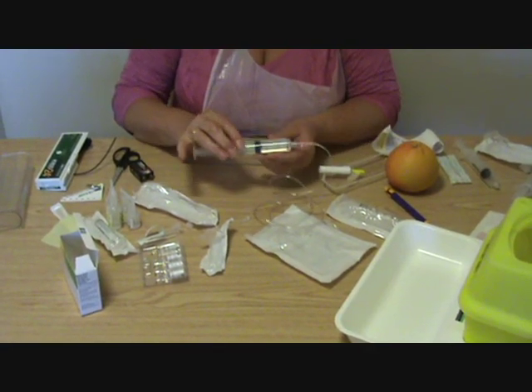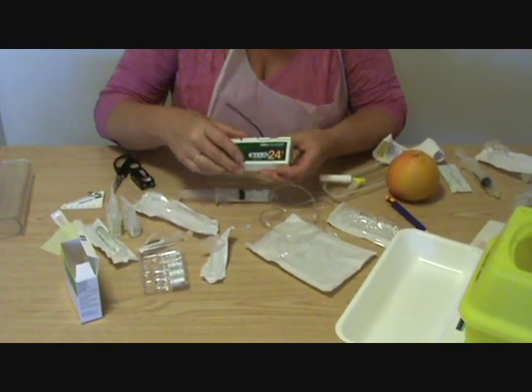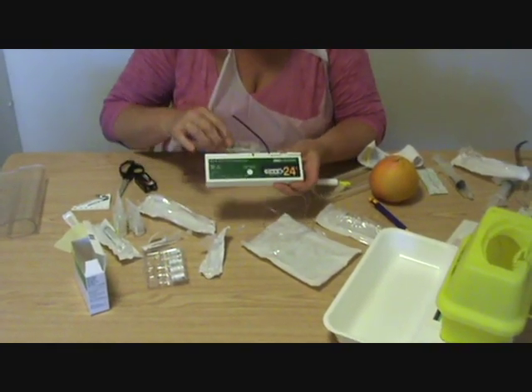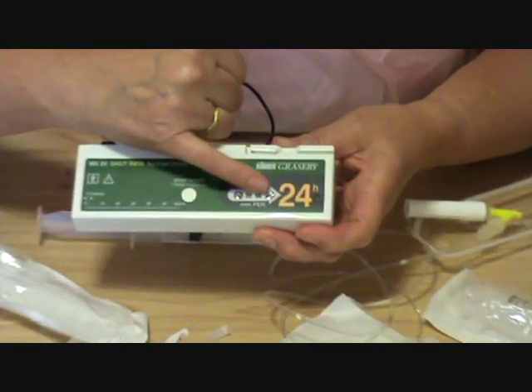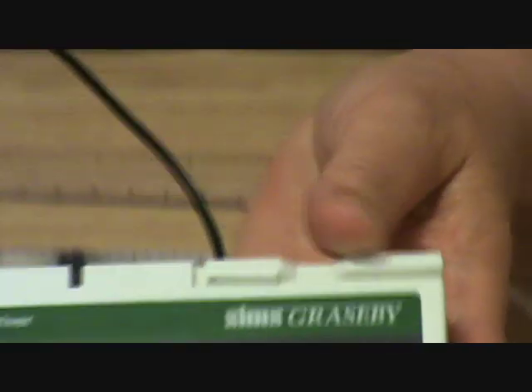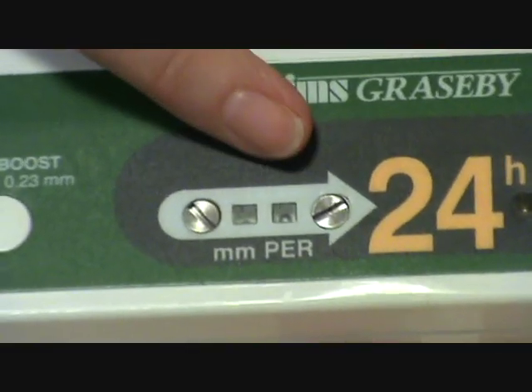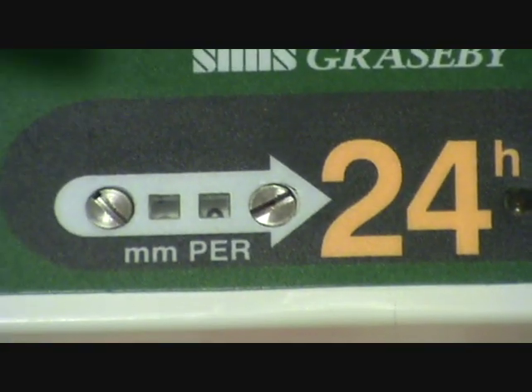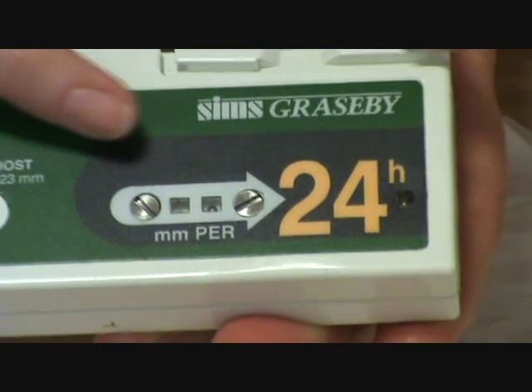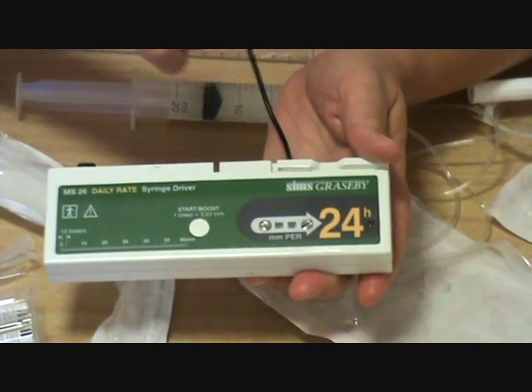I have a syringe with 50mm of fluid in it. I'm going to give all of this — 50mm — in 24 hours. You'll see on there the moment it's set to nothing, zero. So what I'm going to have to set it to will be 50mm of fluid per 24 hours.